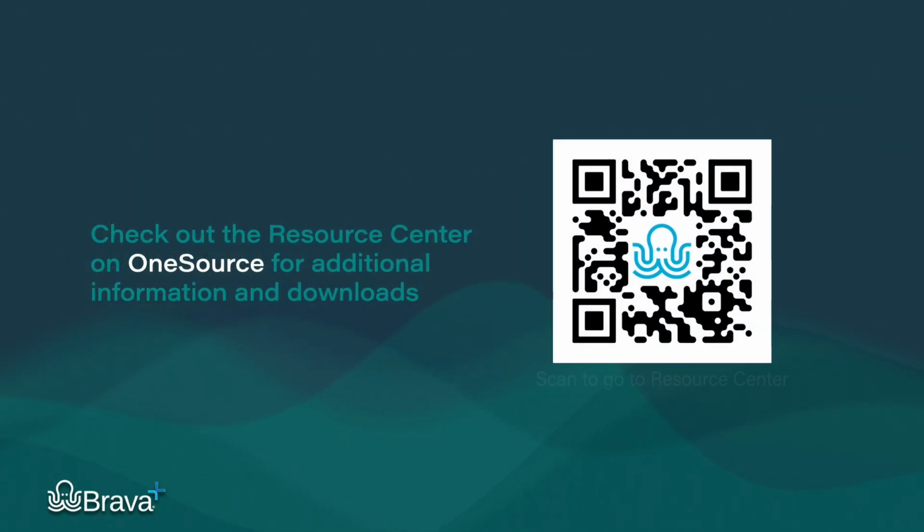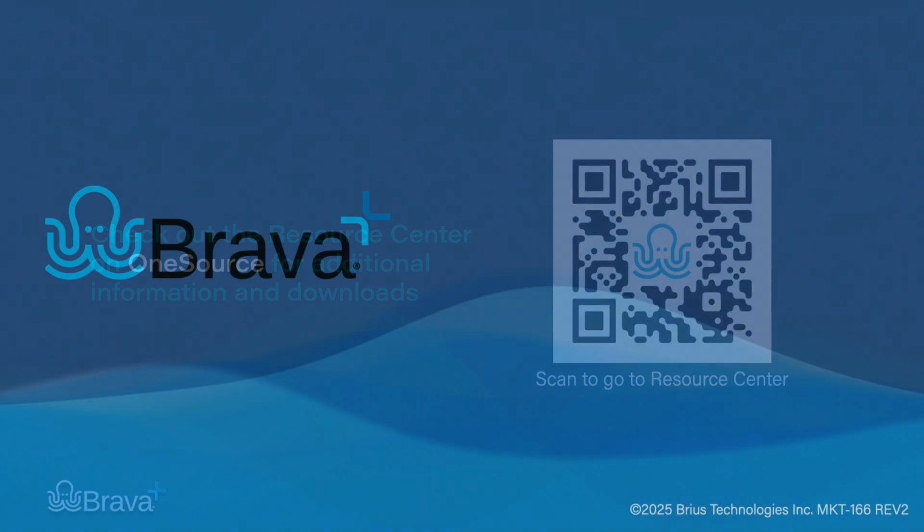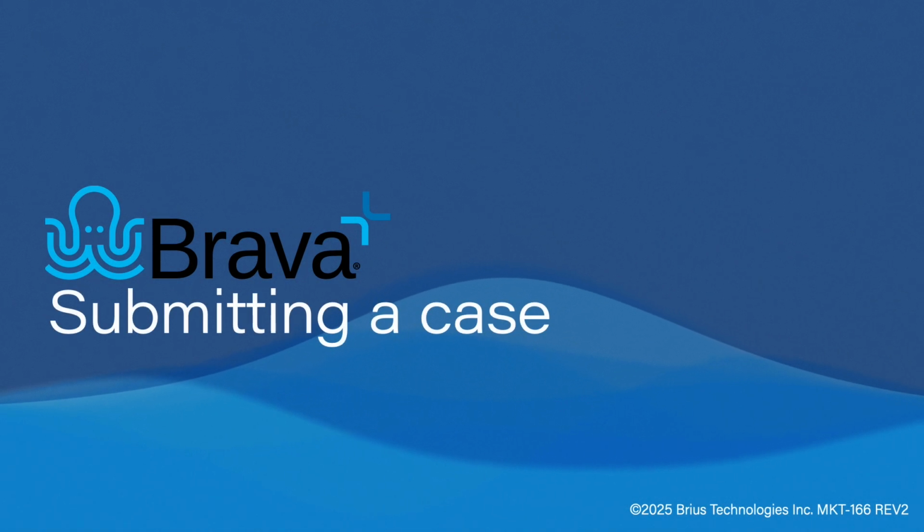Please refer to the Resources section on OneSource for additional resources, including a downloadable prescription form worksheet and the intraoral scanning guide. These resources provide valuable information on intraoral scanning techniques for Brava treatment. This concludes the lesson of how to submit a case.